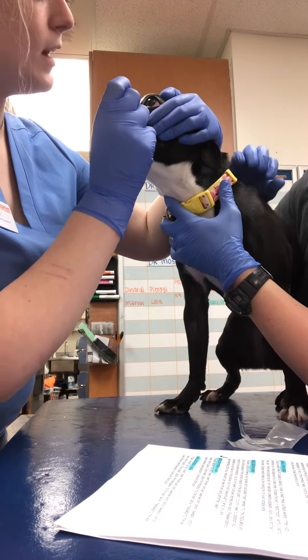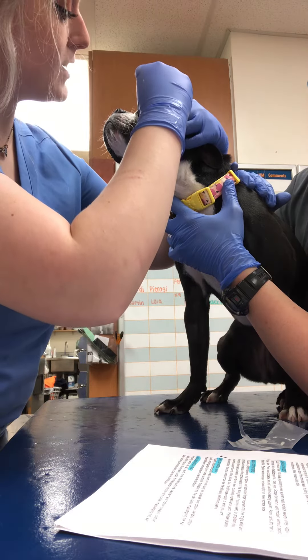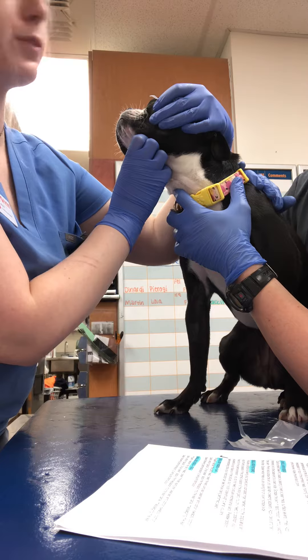I am going to pull down the eyelid lateral to the eye and place it in the space between the conjunctiva and sclera, pinch the eye closed, and we will hold it here for one minute.